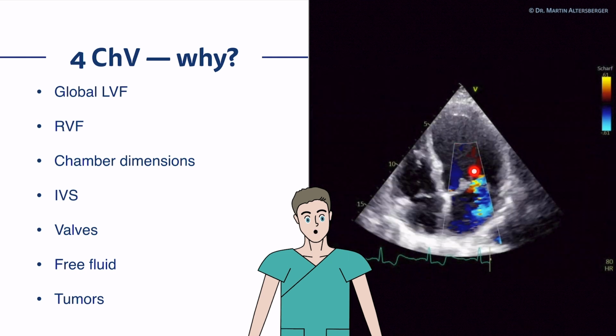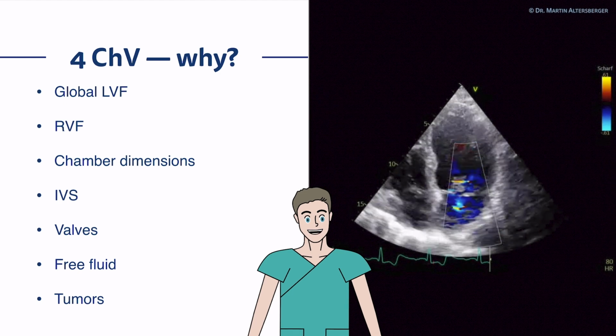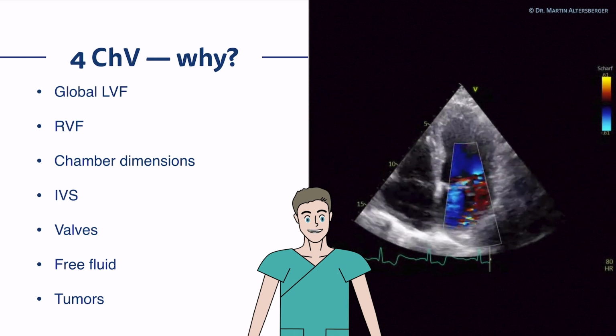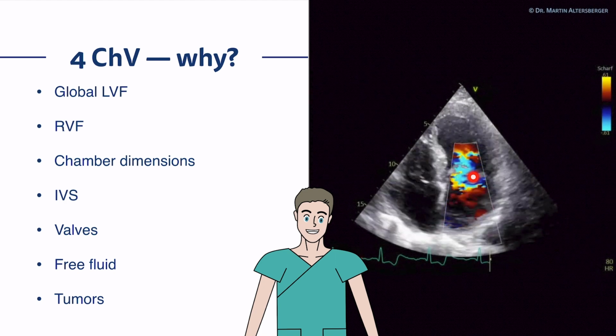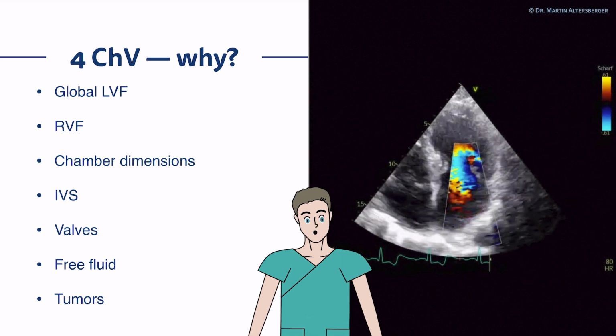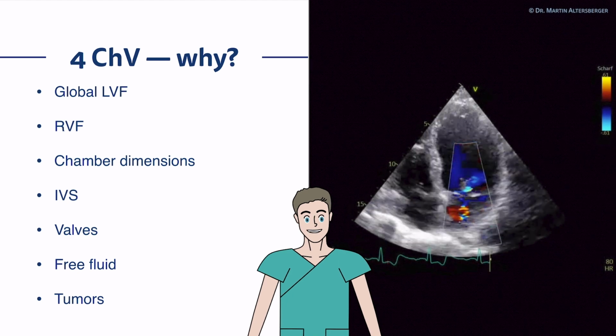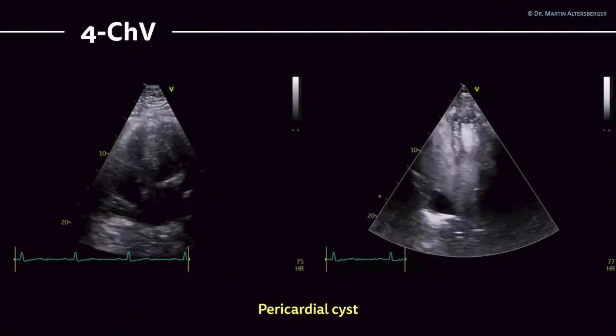There is severe mitral regurgitation. It might not look like this initially, but you see the hyperdynamic LV function, you see the eccentric jet. That is a patient where a flail leaflet was present. So severe MR with a flail leaflet using color Doppler and the apical four-chamber view.